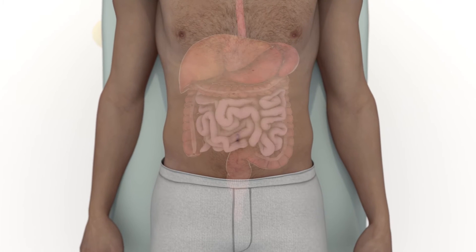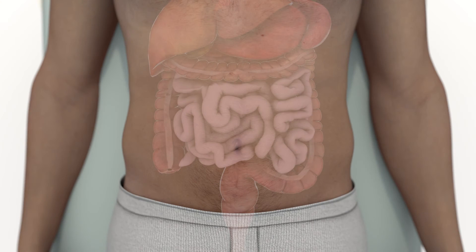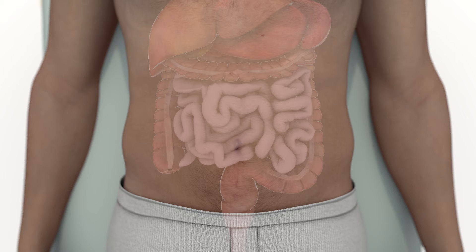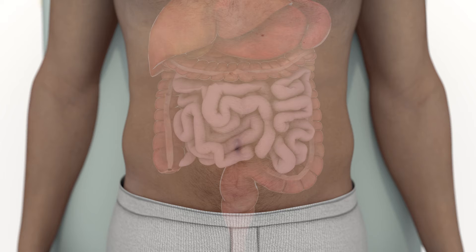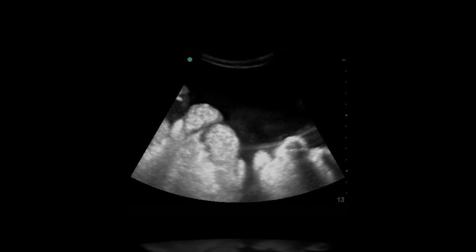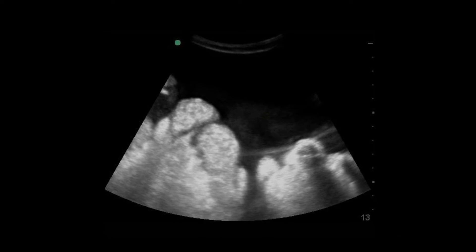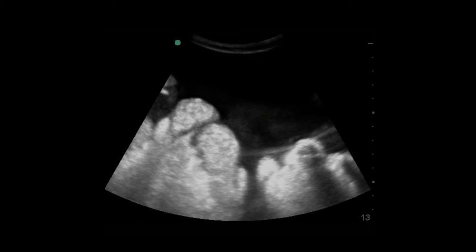The preferred site for paracentesis is the right lower quadrant. This avoids the liver and spleen in the upper quadrants and the sigmoid colon in the left lower quadrant. However, the entire abdomen should be quickly scanned to identify the largest pocket available for aspiration. Collections of ascitic fluid will be seen as large anechoic areas. If the fluid collections visualized are very small or are only present in the most dependent areas such as the pericolic gutters, then the procedure should not be attempted at the bedside.